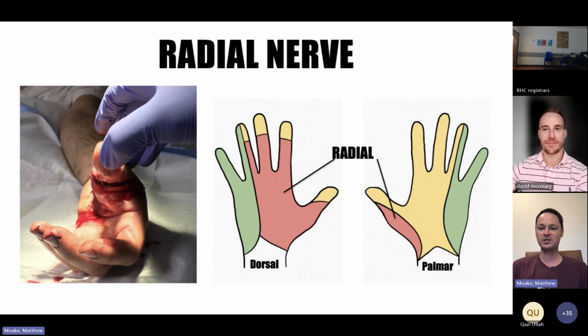My surgeons have been okay with me doing some field blocks for some abscess I&Ds. But usually if I'm going to the trouble of blocking, then I'm just doing the procedure.